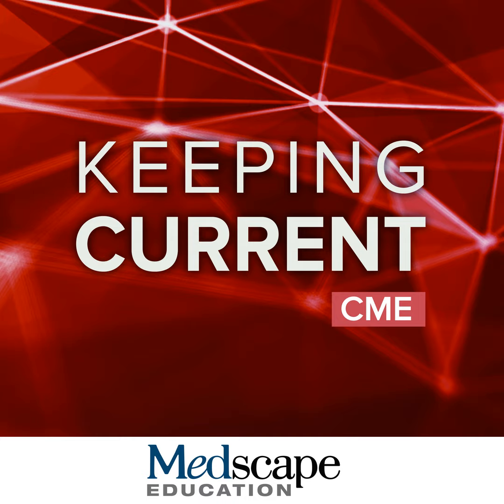But on the other hand, sometimes patients have migraines, they have had them for a long time, and the MRI is just to make sure that there's not an underlying cause. In that case, it's very reasonable to start with a non-contrast MRI. And if everything looks normal on the non-contrast MRI, there is no need to administer a contrast agent. But if you see something abnormal on the non-contrast images, the patient may need the contrast. And again, those are general considerations, but we make those decisions individually for each patient.